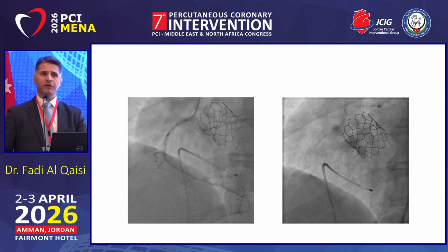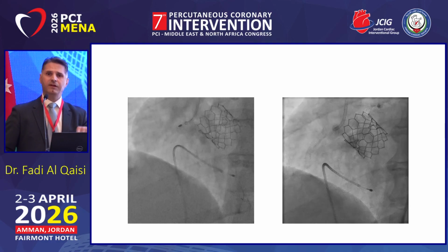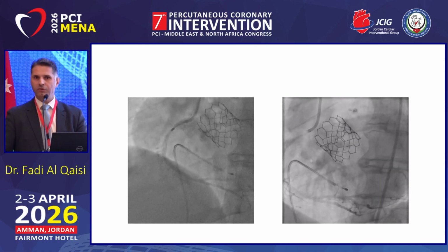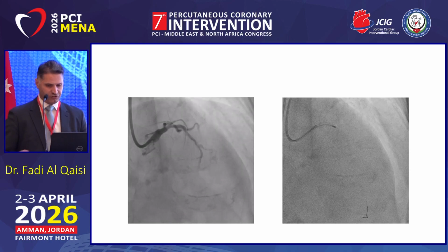You can see here we did a previous TAVI for him. During the TAVI I did an ultrasound and told him, listen, this is heavily calcified, I'm not going to touch it with the balloon, let's reschedule it for a rotational atherectomy.